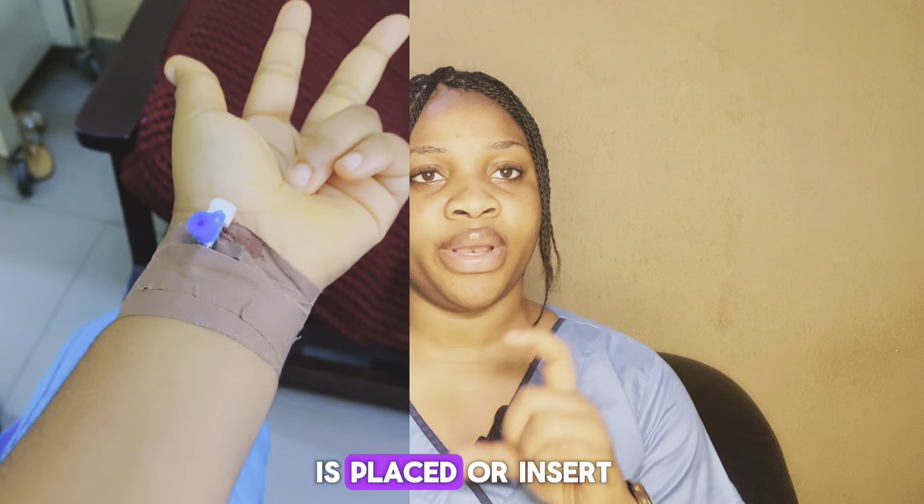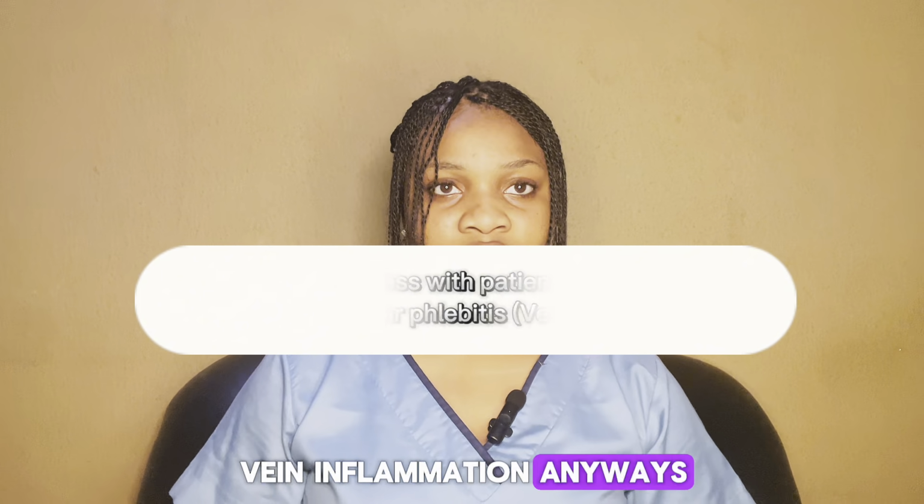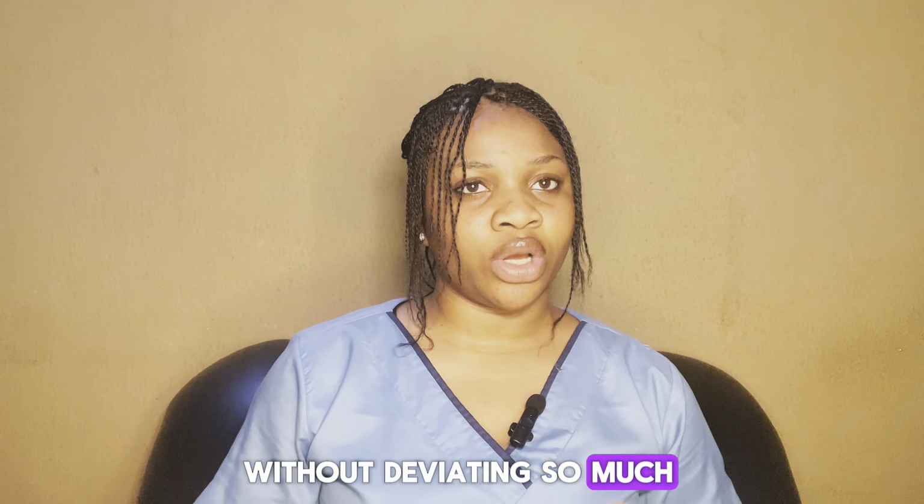In my last video, I said that the best vein to insert an IV cannula is the superficial vein of the upper extremity. And this is why: it interferes less with the patient's mobility and it poses less risk of phlebitis, which is inflammation of the vein. Anyways, without deviating so much from this topic and causing confusion, note that IV cannulation is one of the core clinical skills to know. That means if you don't know any other procedure, you should know how to insert a cannula. You should know how to cannulate a patient.